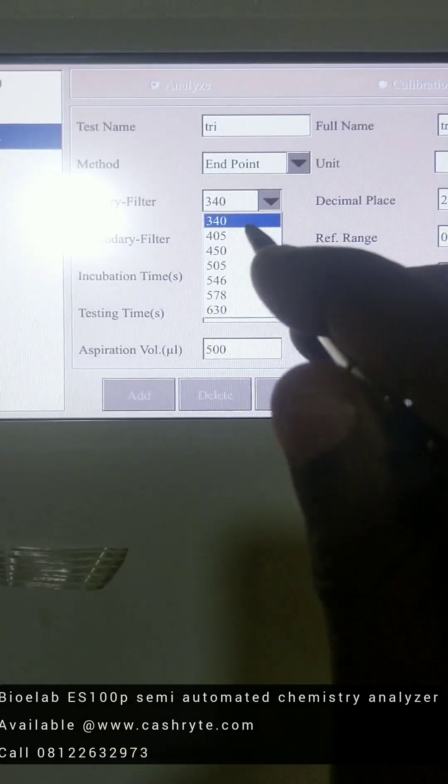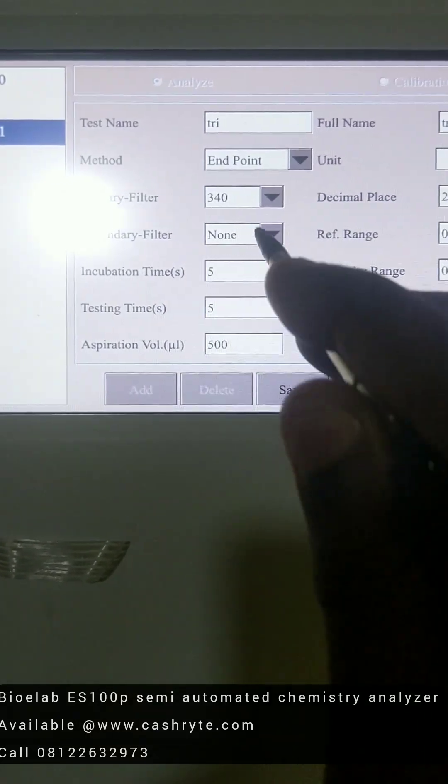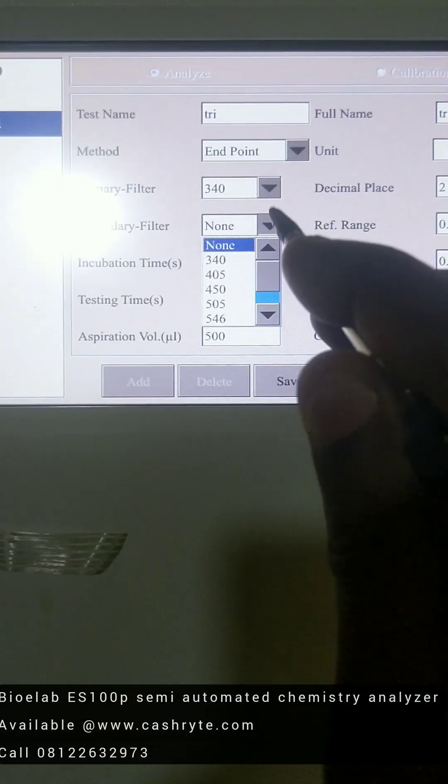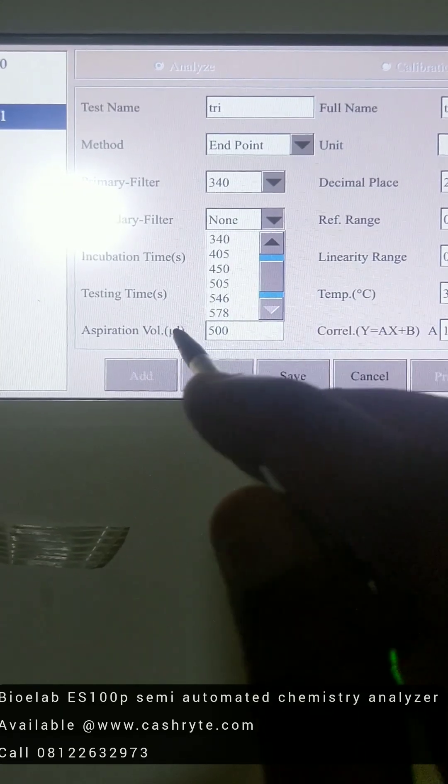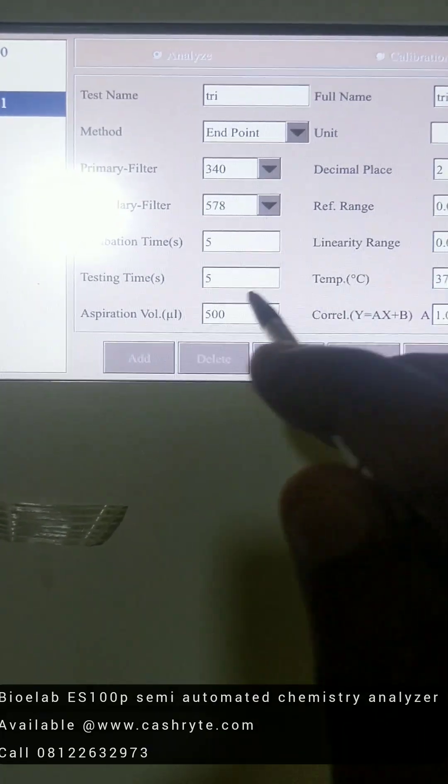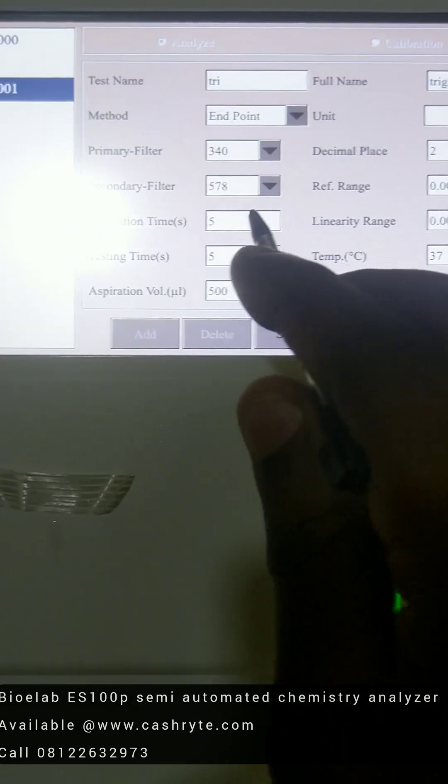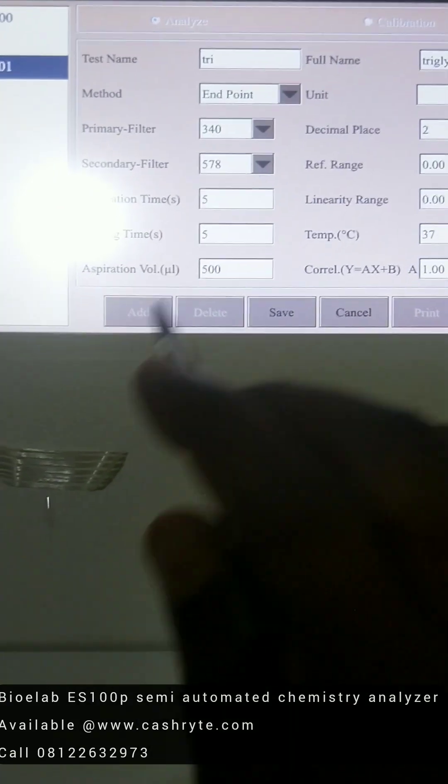Then you set your wavelength. This is the primary wavelength. Then secondary wavelength, depending on what the manual says. Then you choose your incubation time, then you choose your testing time.